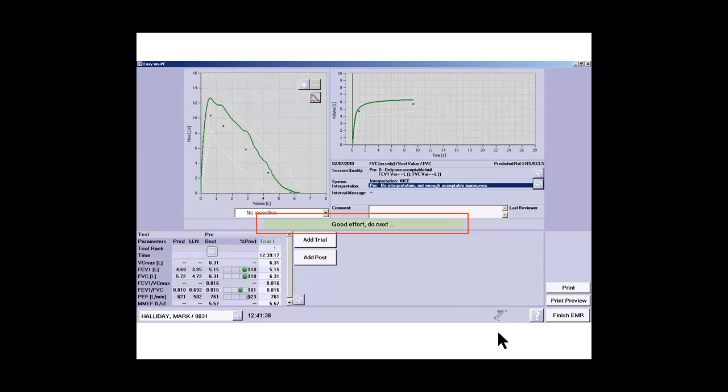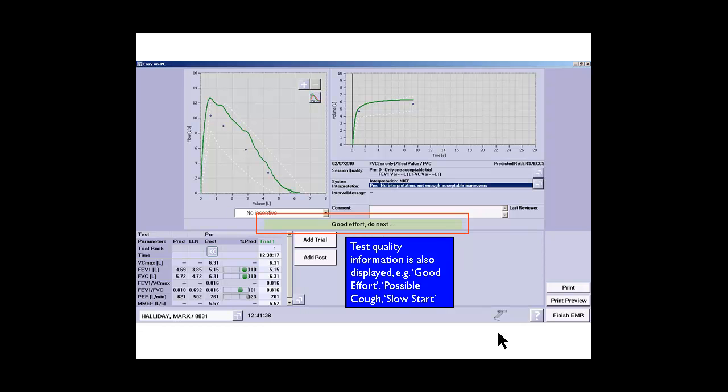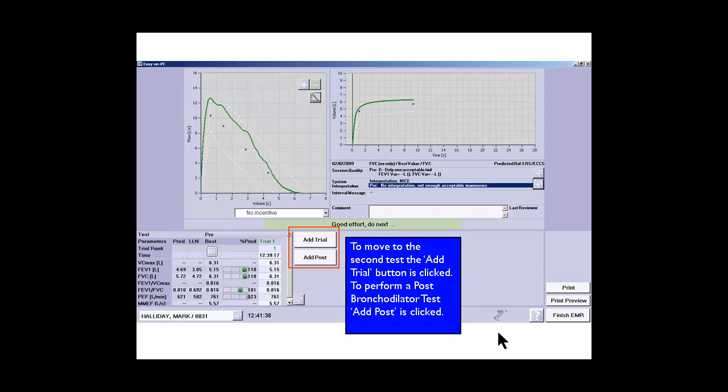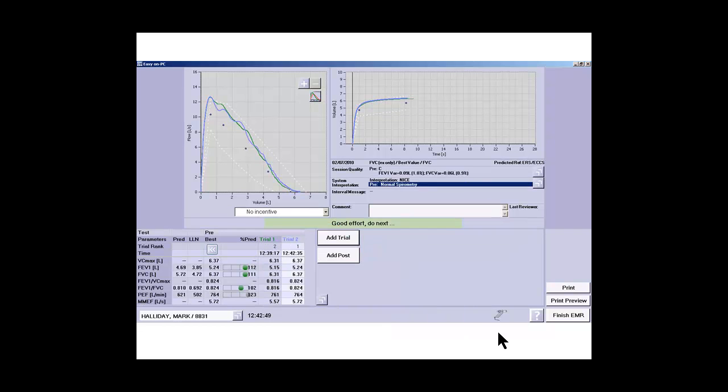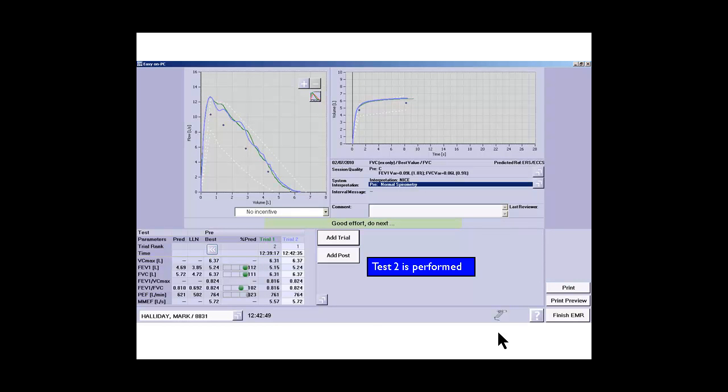We're now going to do another trial by pressing the add trial button. The second blow is performed. We can see again that this was a good effort.